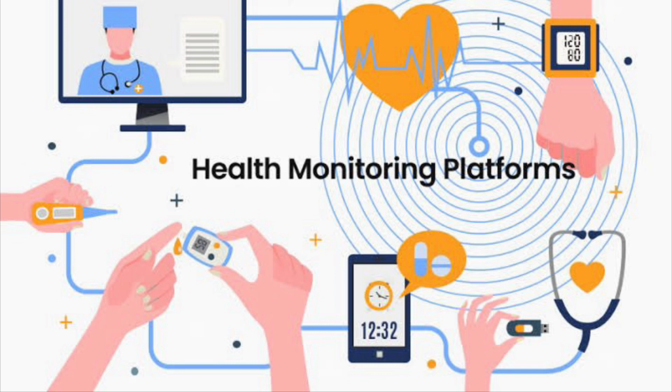Step 5 is to train patients and clinicians. The problem with this wearable technology is that it is device dependent. So if the device is not functioning properly, naturally the data that is generated can create problems. It may not be correct.